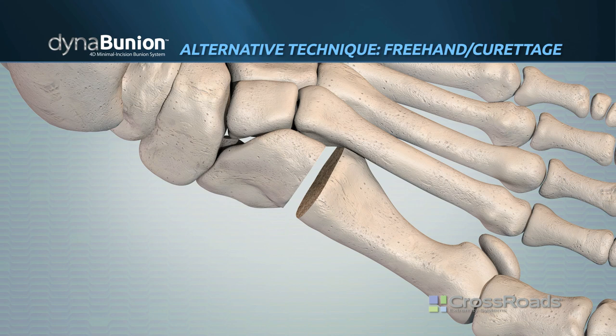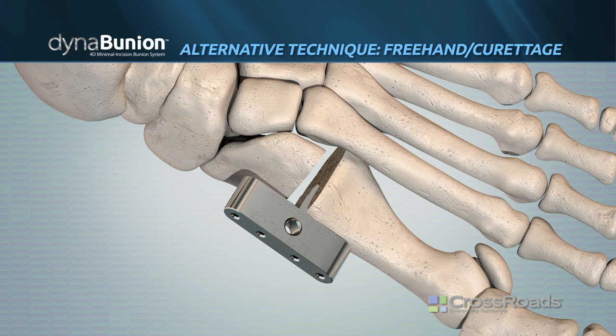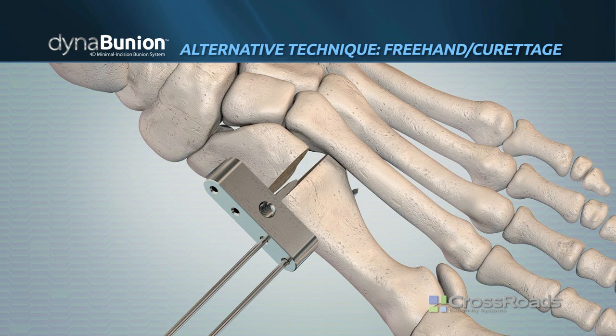Place the freehand wire template into the joint at a dorsomedial position. While ensuring the paddle is flush with the metatarsal joint surface, pin a short 2mm wire into the second most distal hole of the wire guide. Place a long 2mm wire into the most distal hole of the wire guide.